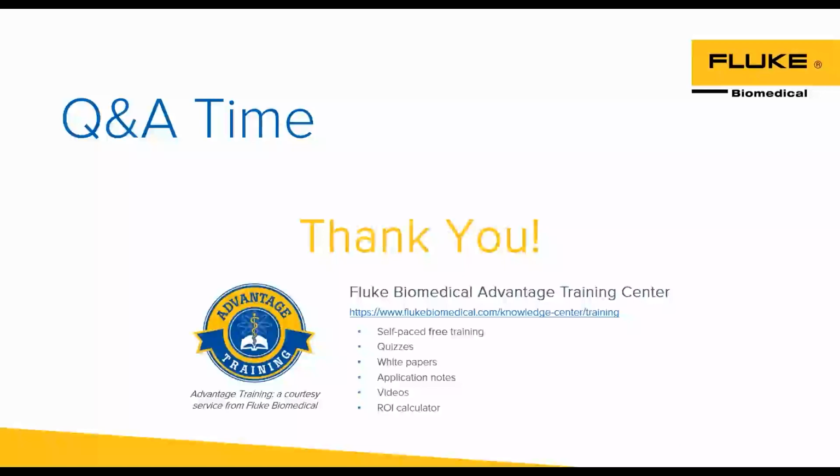Great, thank you, Elliot and Justin. Next question here. I have a customer asking about the difference between the 6000D and the 7000 DP that Fluke Biomedical has to offer. The biggest difference, like we talked about earlier in the webinar, is the ability to use the 7010 load box.